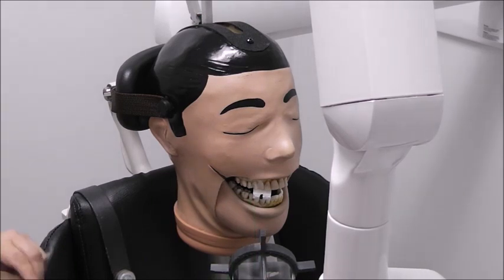This completes the lab demonstration for the anteriors on the right side using the bisecting technique.